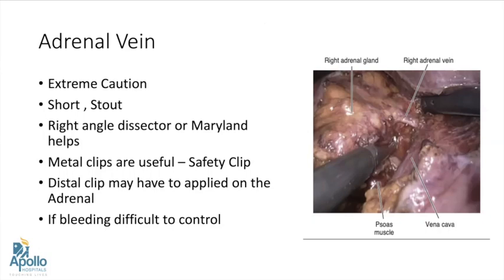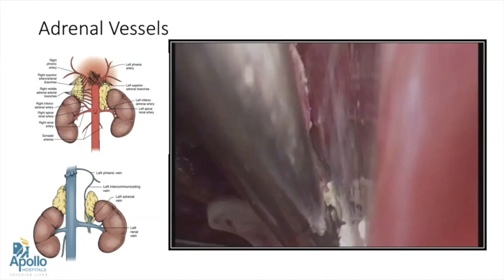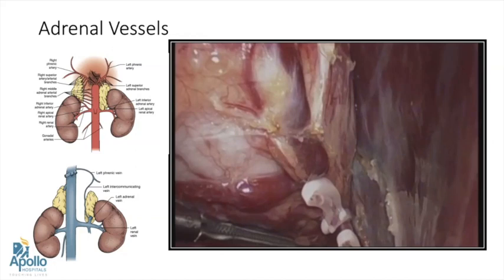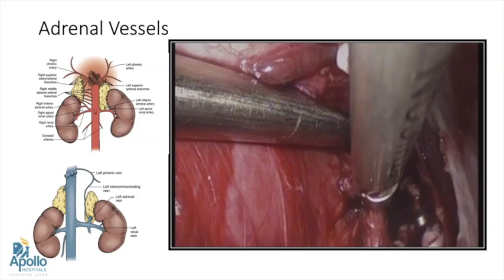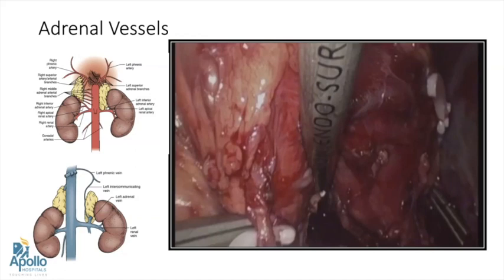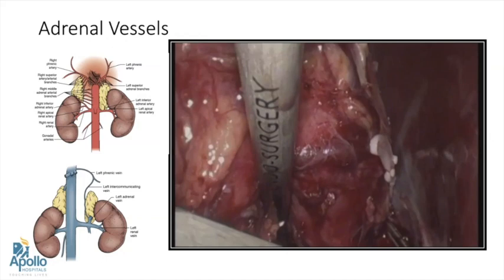There are no fixed anatomical arteries applied to the adrenal, but the vein on the right hand side lies in a more cephalad direction and I usually prefer the first clip to be a metal clip. As the vein usually drains posterolaterally, sometimes we may not be able to see the proximal margin — in those cases metal clips really help. Once that is done, the rest of the surgery is pretty easy. All the medial attachments of the adrenal should be taken care of. If any tubular structure is seen, then we can either clip them or cut accordingly.